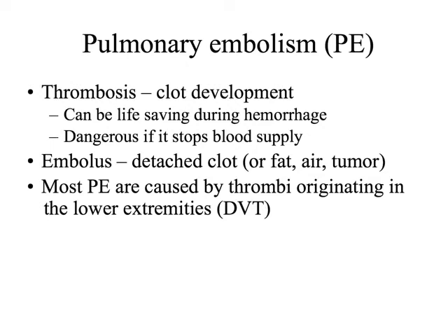Nevertheless, most PEs are caused by thrombi originating in the lower extremities, like deep vein thrombosis. So it's really common for us to see ultrasounds for DVTs, and then follow it up with a PE study.